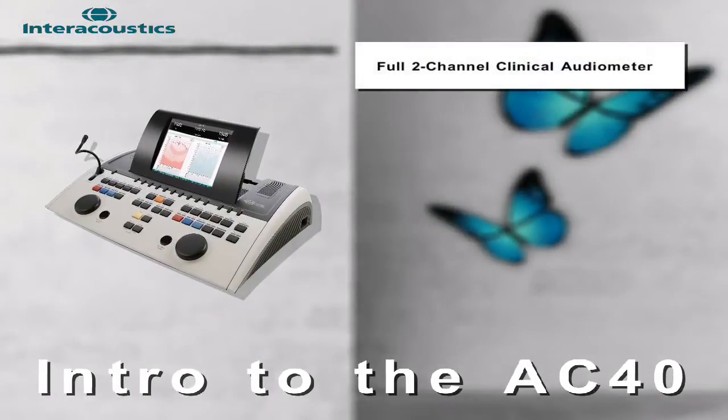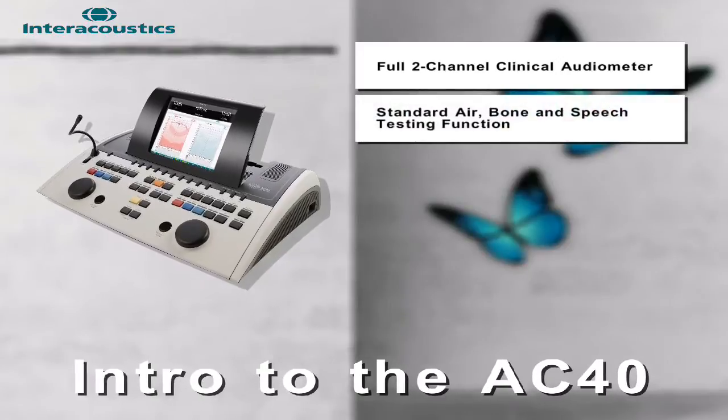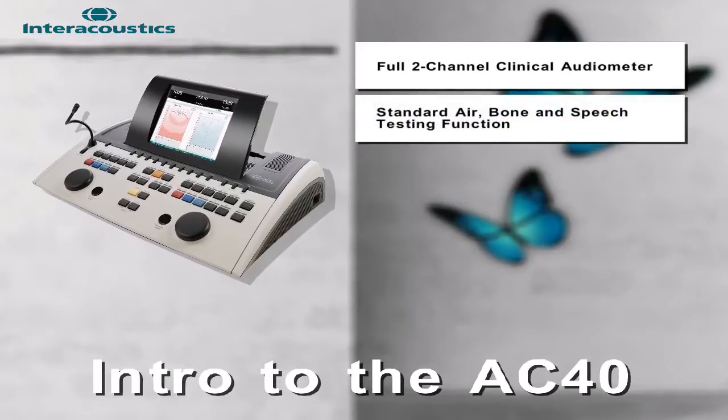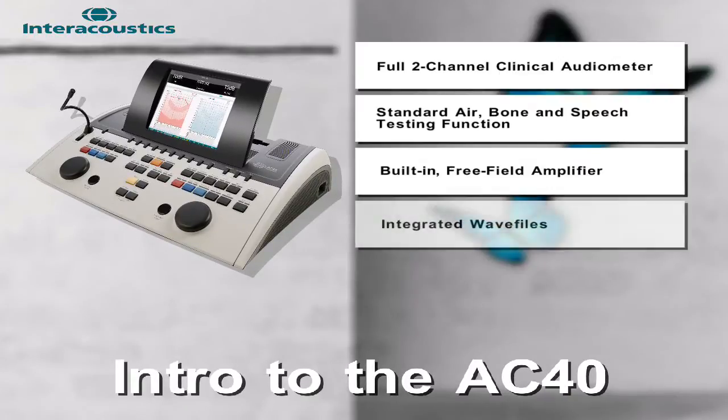The AC40 is a full 2-channel clinical audiometer offering standard air, bone, and speech testing functions and a built-in free field amplifier. Integrated WAV files within this device allow for pre-recorded word lists to be presented for improved consistency and reliability during speech testing.